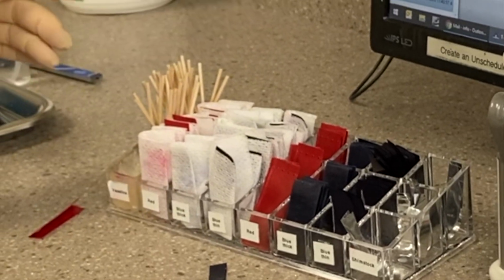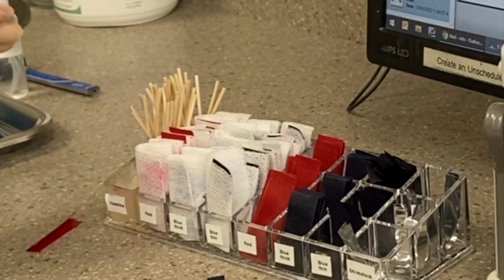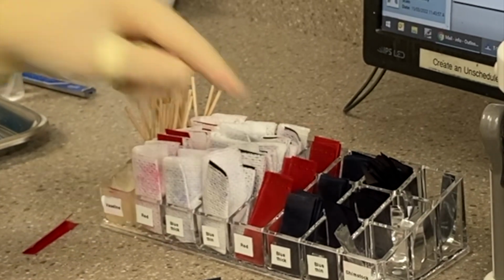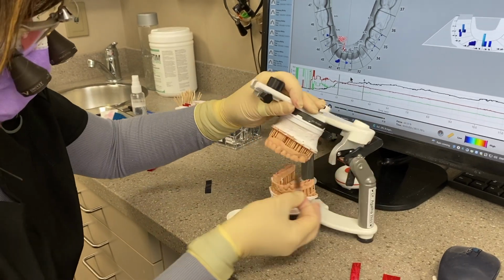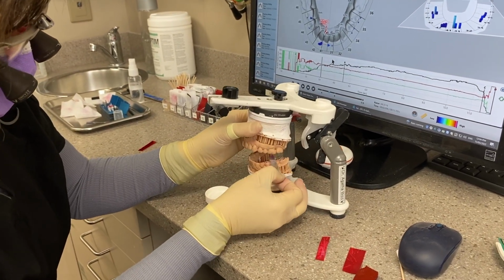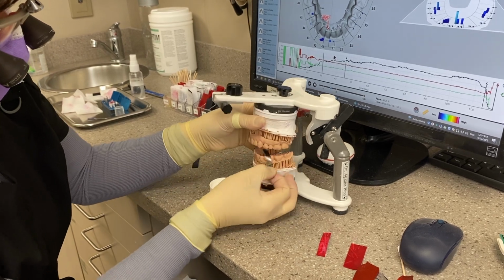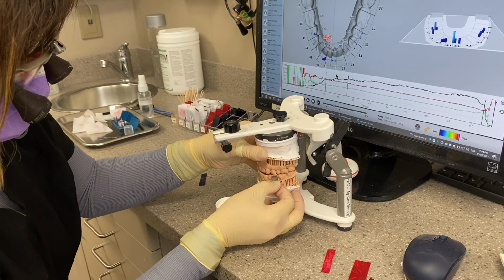The wrapped one has Vaseline on it, so it marks really well. These are not coated with Vaseline. Q-tips in here, and then additional shim stock so that I can just grab some as I need it. So we do that with every adjustment. Every operatory has one of these. Because we go through so much articulating paper in this office, it's ridiculous.